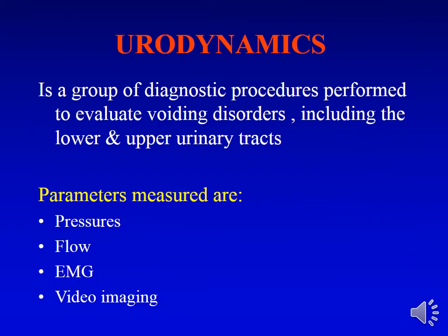Now basically, what's urodynamics? Urodynamics is a group of diagnostic procedures performed to evaluate voiding disorders, including lower and upper urinary tracts. Normally, it implies the lower urinary tract, but there are some urodynamic procedures which you use for the upper urinary tract itself. Basically, what we do is a diagnostic procedure by placing catheters into the urethra and the rectum to determine the bladder voiding disorders. That means the bladder passing urine, any problems or anything like that. The parameters measured during the urodynamic are pressures, flow, EMG, and video imaging.